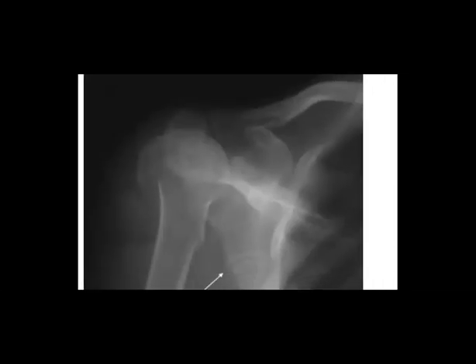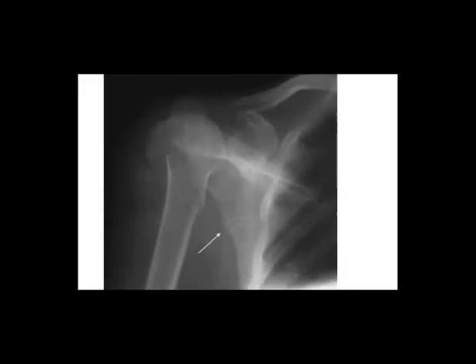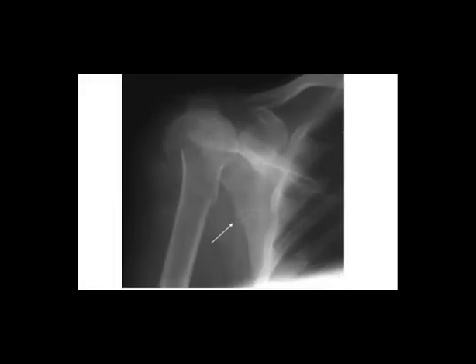So let me show you the scapula then. So here, you can see the scapula, the axillary border of the scapula.